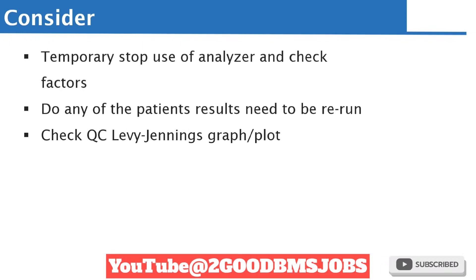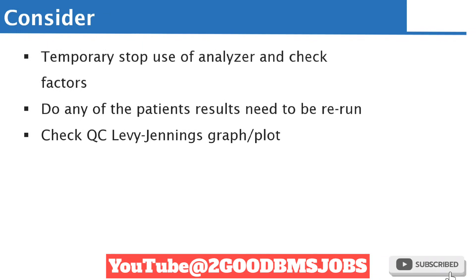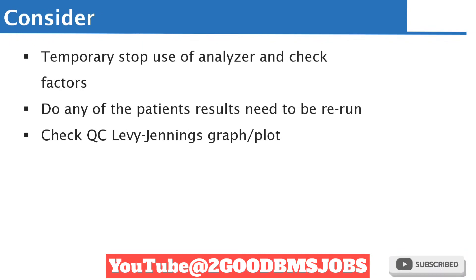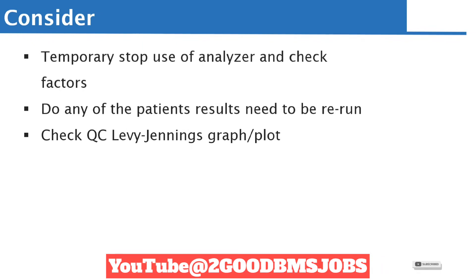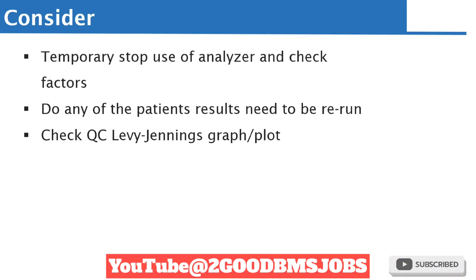When you open the Levey-Jennings graph, you need to know exactly what failed. For example, if you run a quality control sample on many parameters, you need to ask yourself: what exactly is failing? Is it all the parameters failing, or just one? For example, if you run a quality control on a full blood count sample, that measures hemoglobin, hematocrit, WBC differentials, and so on.